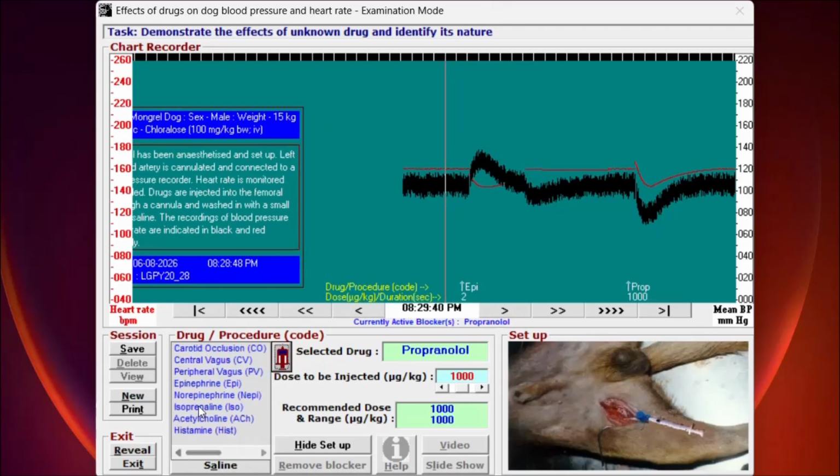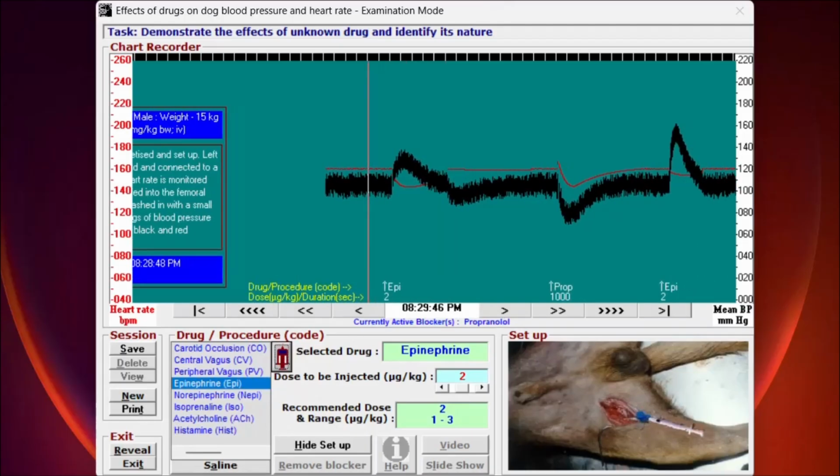इसके बाद again we are going to give the agonist, so we are going to select epinephrine once again and then inject। अब आप यहाँ पे देख सकते हो कि ये जो रेस्पॉन्स है ये एक प्रेशर रेस्पॉन्स है, यहाँ पे मीन आर्टेरियल ब्लड प्रेशर बढ़ चुका है, which is exactly opposite of what we have discussed in vasomotor reversal of Dale. So this is what we call vasomotor re-reversal of Dale.